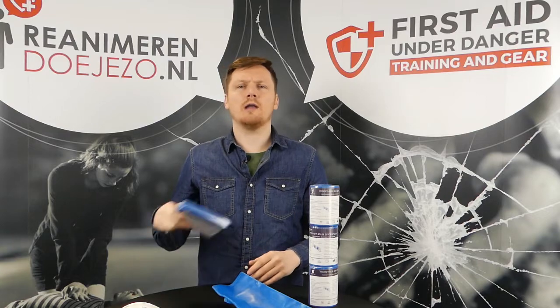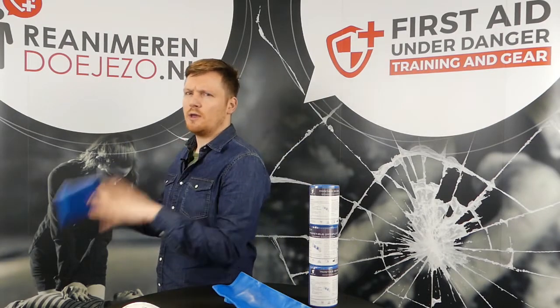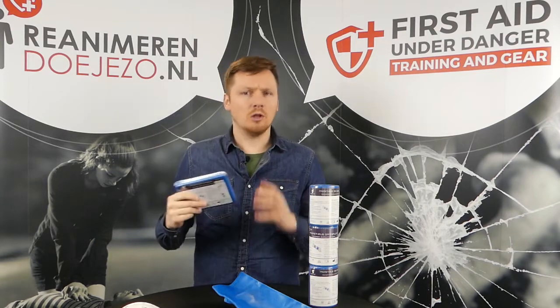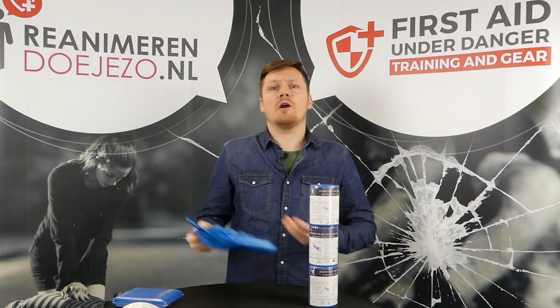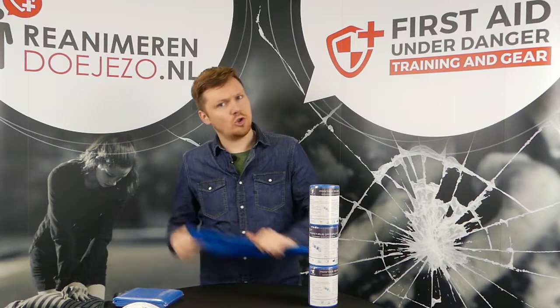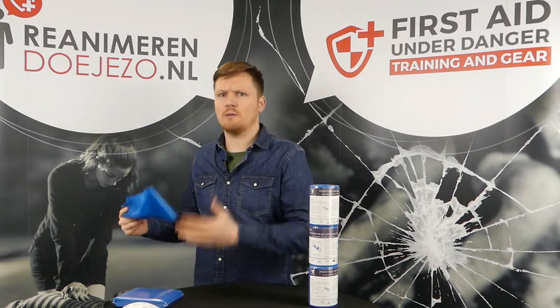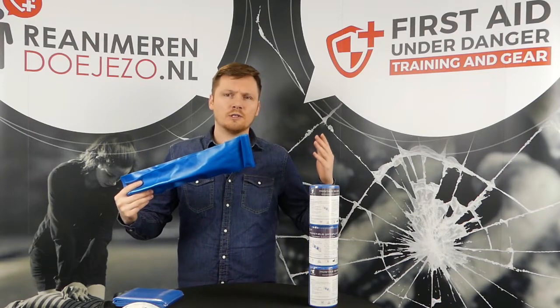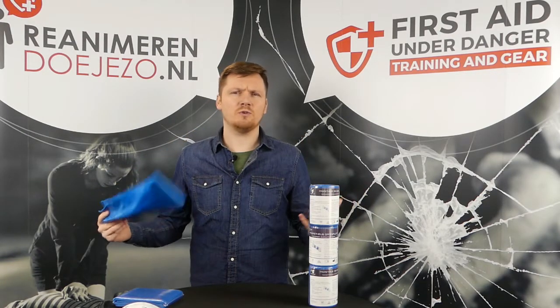I wouldn't go on a survival trip, hiking, or even when going away with the army without a few of them. There are a million reasons why you want to use it. You can use it as a paddle or a shovel, you can use it to keep your coffee warm, you can use it on animals, and you can use it for splinting an arm, a leg, or even a neck.